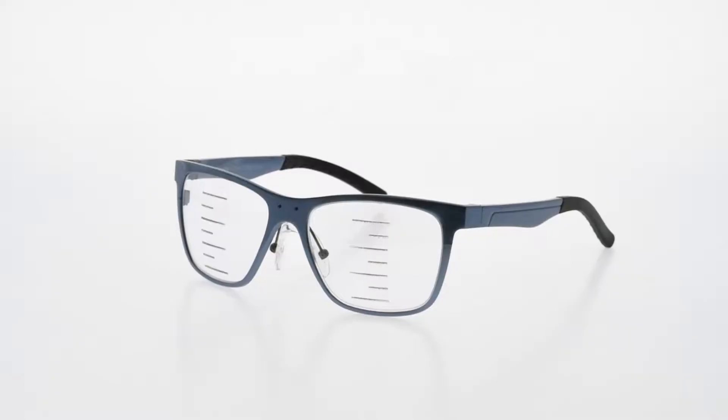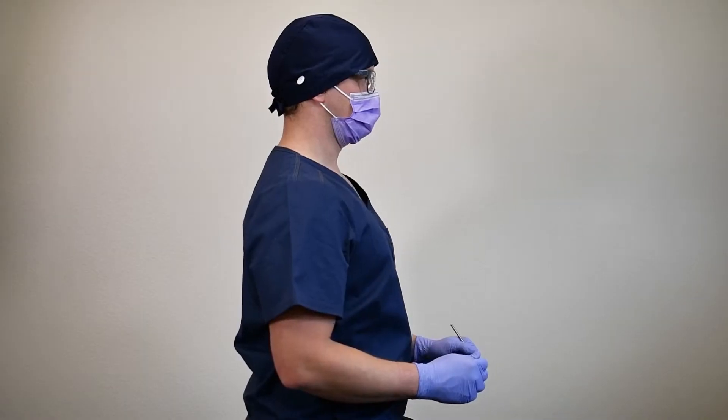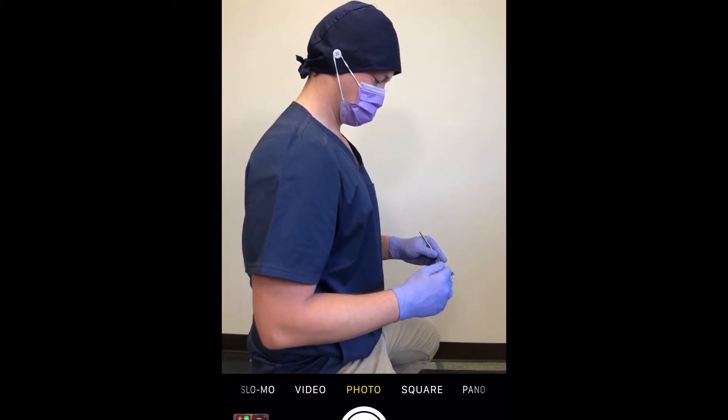In these videos we'll be going over the fitting process for your custom-made ergo prism loupes. Specifically, we're going to make sure your ergo fit frame is on correctly, find your comfortable ergonomic posture, measure your ergo prism working distance, and take your fitting photos.